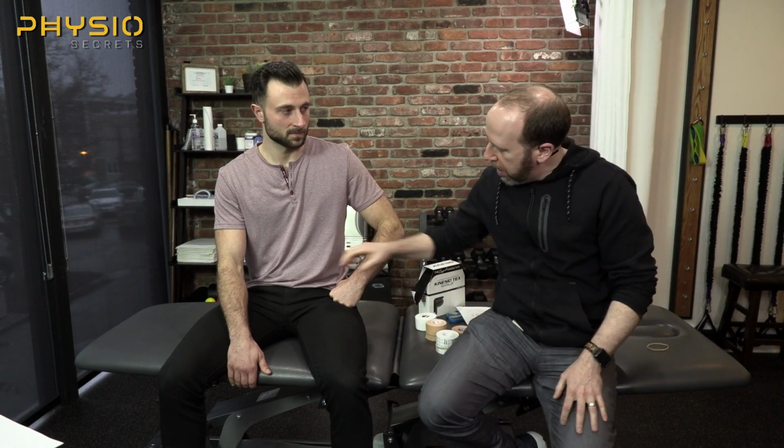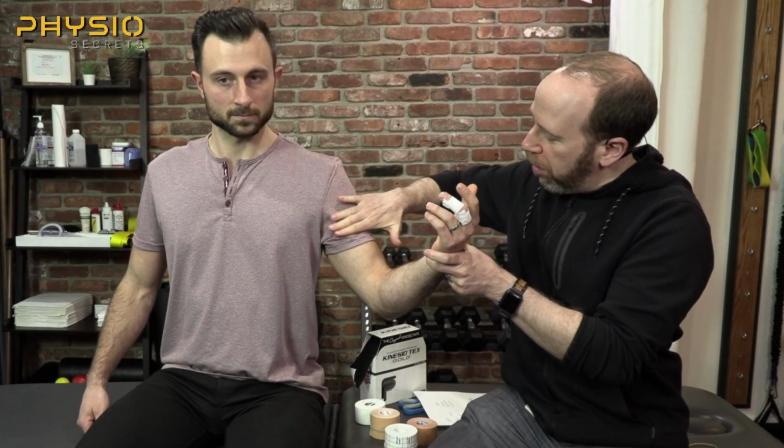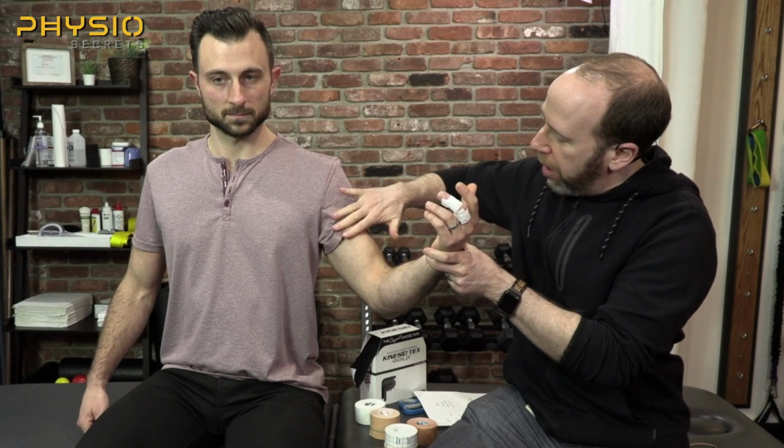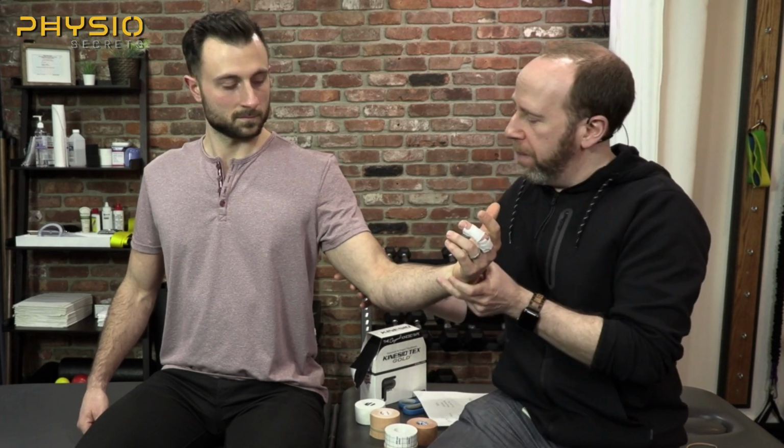And then for mechanical stuff, preposition is really important. So let's just say for 1 second, I wanted to tape, let's do the arm here because it's easier to see. Let's say I wanted to support his biceps. So if I apply the tape, I need to apply it across the joint from the front of the joint right here to block extension of the elbow. Let's just say that was my goal for now, right?